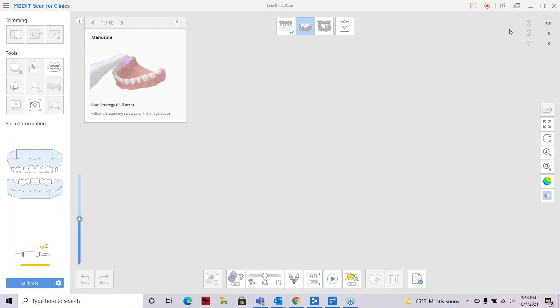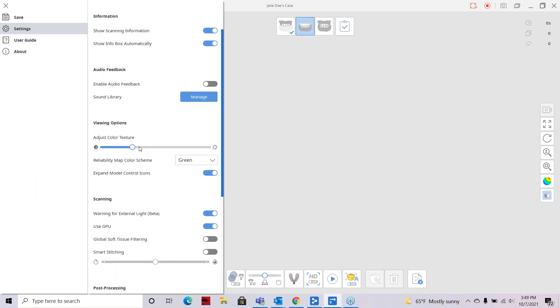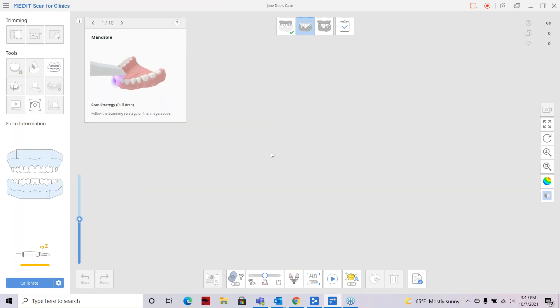To start with, we're going to look at the smart stitching feature. In order to access smart stitching in your menu, go to Settings and you can scroll down to see smart stitching right here. This can be turned on or off by clicking the little slider. We're going to turn our smart stitching on. You can see I previously scanned a maxilla here and we're going to work on the mandible right now.